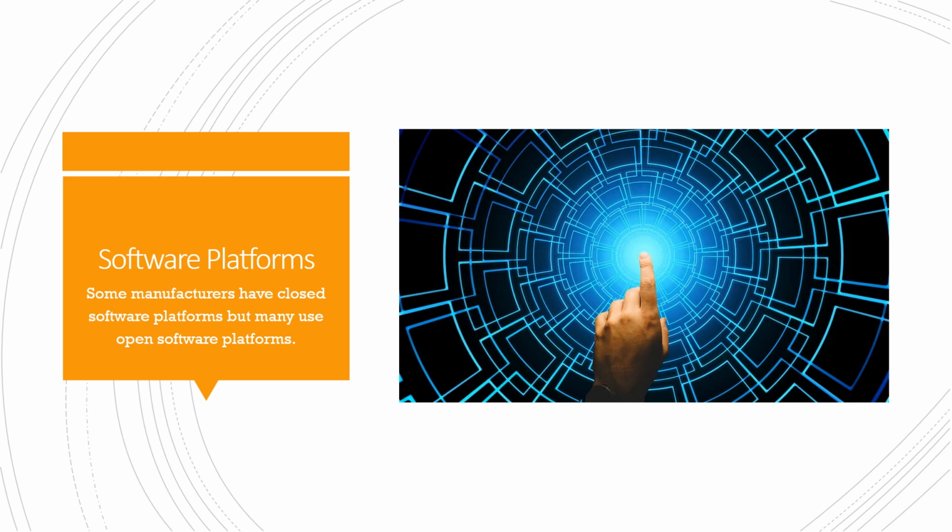Software platforms. Some manufacturers have closed software platforms, which means that only systems that are the same can be used with that software. So if you get a CEREC, only CEREC systems will work with that specific software, just as an example.